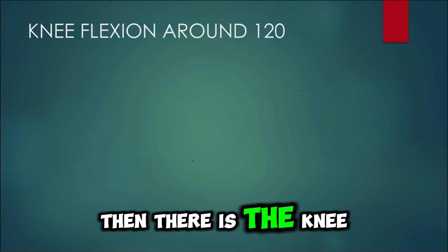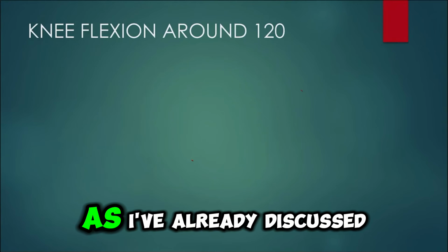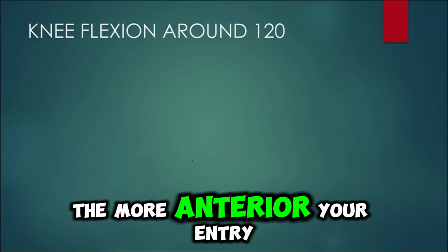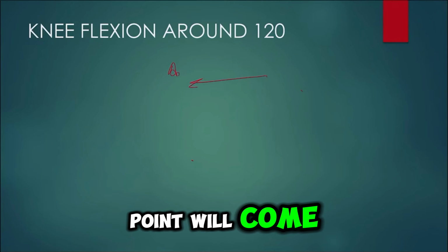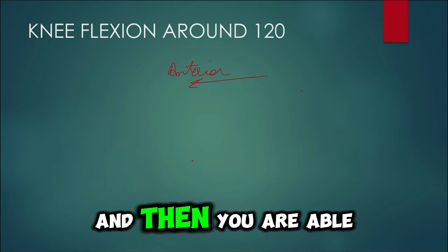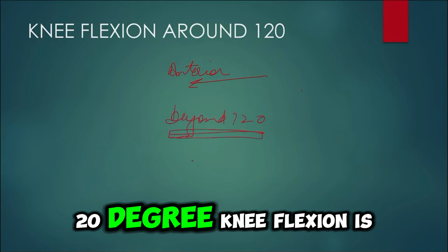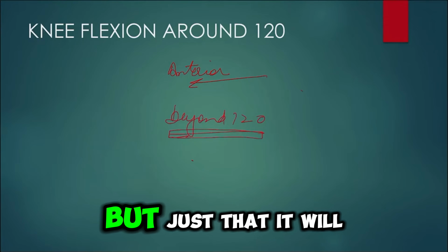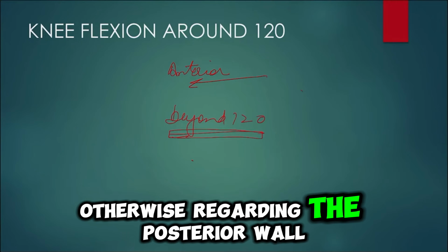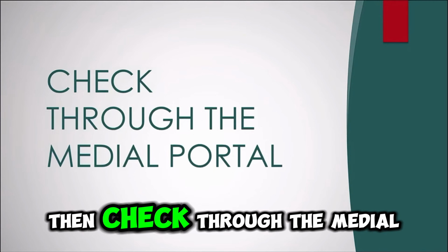Then the knee flexion should be around 120 degrees. Why I am saying this is, as I have already discussed, the more you flex the knee, the more anterior your entry point will come, and then you are able to easily make the tunnel. Beyond 120 degrees of knee flexion is also acceptable, but it will make your tunnel short. Otherwise, regarding posterior wall blowout, it is safe too. Then check through the medial portal.